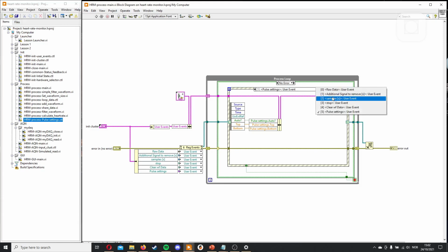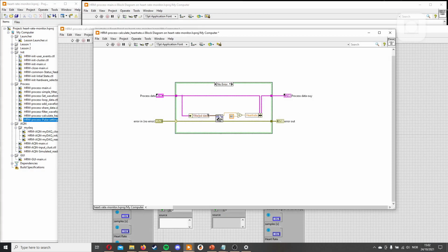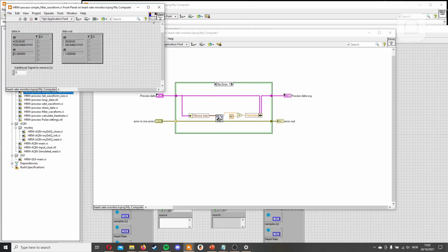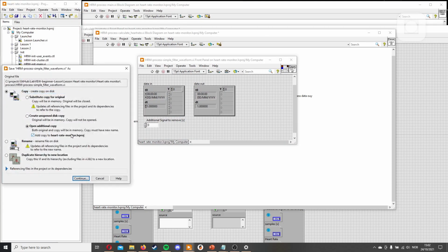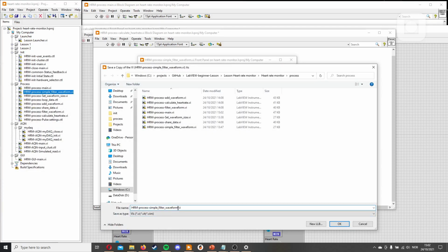Because the use will actually be in here. We need to make a case where it either just does this thing or it does our other VI. So let's start by making the VI that can filter it manually. It will have the most similar inputs as the simple filter waveform, so I'll just reuse it for simplicity. Let's call it manual.